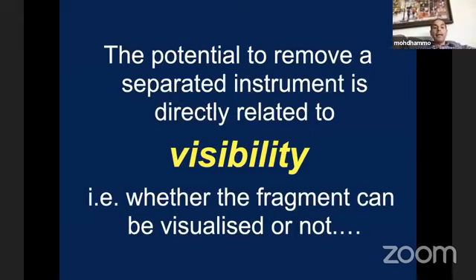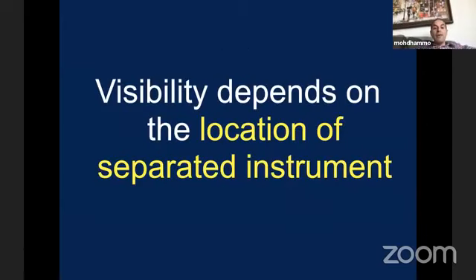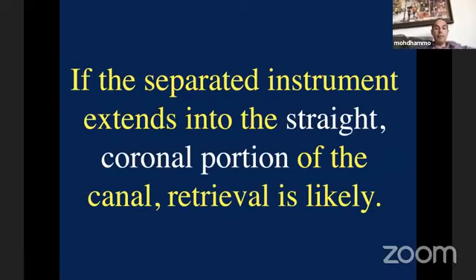For me, the potential to remove a separated instrument is directly related to visibility. So my decision to remove or not to remove a broken instrument depends mainly on visibility, whether the fragment can be visualized or not. Visibility depends on the location of the separated instrument. So remember, when you want to remove an instrument, you should see the broken instrument before placing your ultrasonic tip.